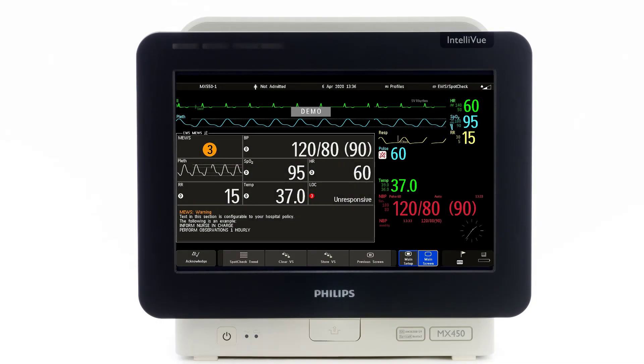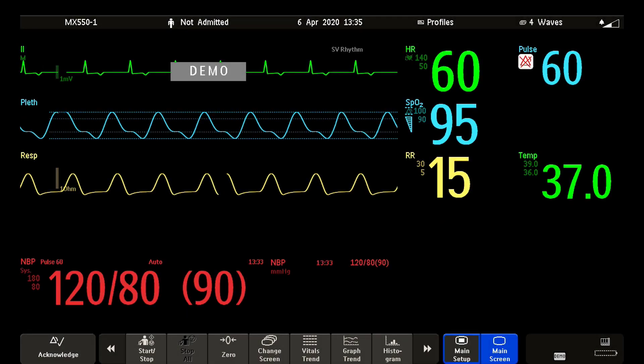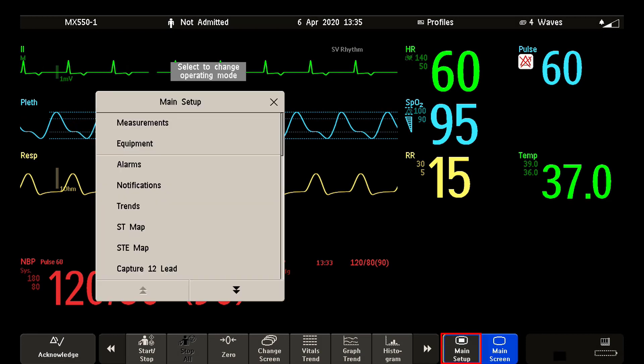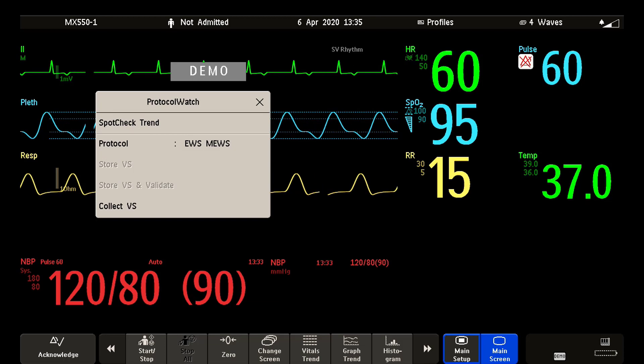Some of our Intelliview patient monitors are equipped with an early warning score application. You can use an early warning score to detect early signs of patient deterioration. To know if your monitor is configured with an early warning score, open the main setup menu, check if you see Protocol Watch in the menu, and then check if you can enable EWS.